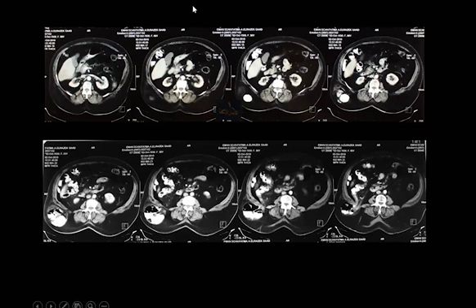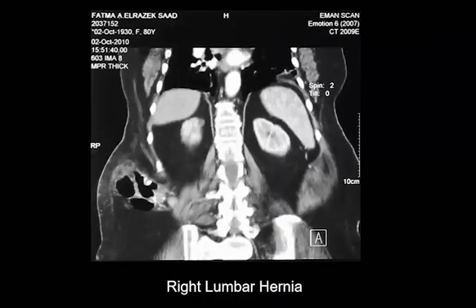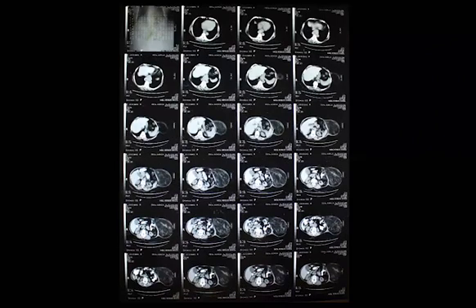At times parietal masses are not so clear whether they're hernias or not, and you may want to know the contents. You may not be very happy to rely on your clinical assessment. This may happen. You'll be requested to comment on all the findings irrespective of their importance, because from a radiology point of view, you need to screen the image for all possible pathologies. You should not exclude hernias.